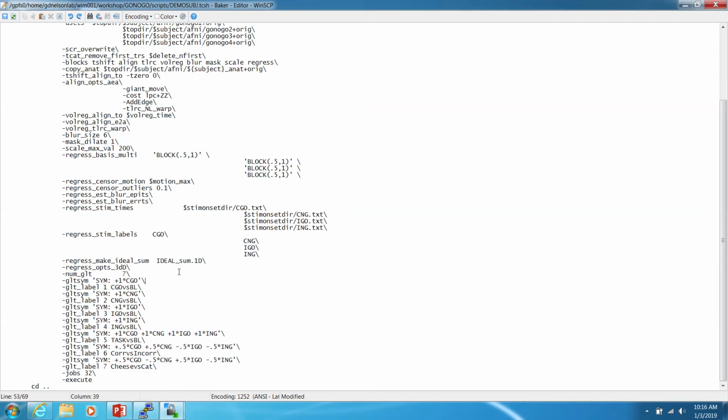So in functional neuroimaging design, you get activation that's related to events within your task. The problem is along with all of those, you get a bunch of other junk, like noise from your heartbeat and your breathing, and you get drift within the scanner's signal over time. Some of that gets accounted for in our regression anyway, but there's a bunch of stuff, and there's a bunch of unknown things that you're not sure where they come from, but aren't related to your task.